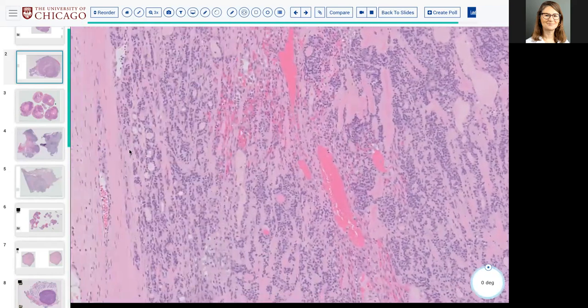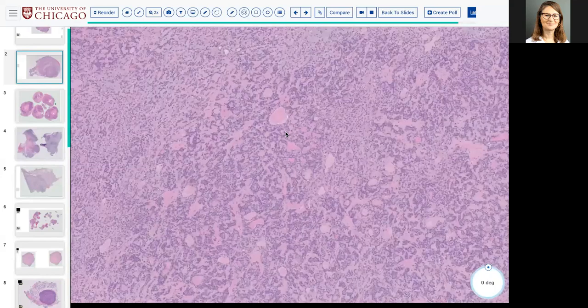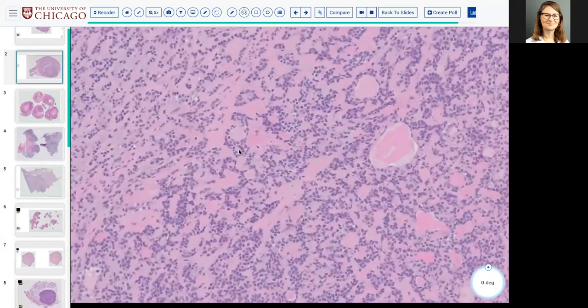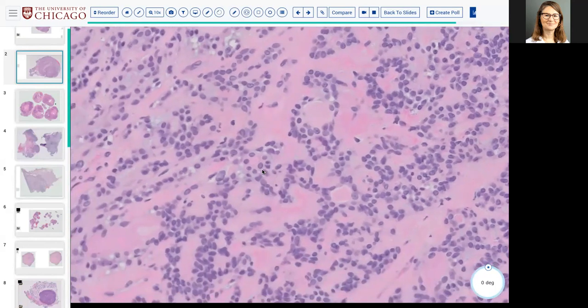But one thing I will argue is that sometimes when we talk about one versus two cell types, it's not necessarily always that there's a drastic shift in morphology of the two cell types, but more of, is there an architectural separation of the two cell types? One might argue in a purely myoepithelial tumor, you really shouldn't see ducts, because ducts are formed by epithelial cells, often with a combination of myoepithelial cells at the abluminal area, right?